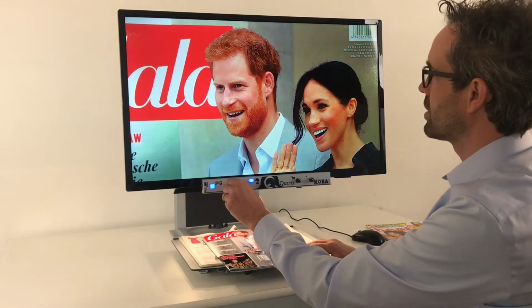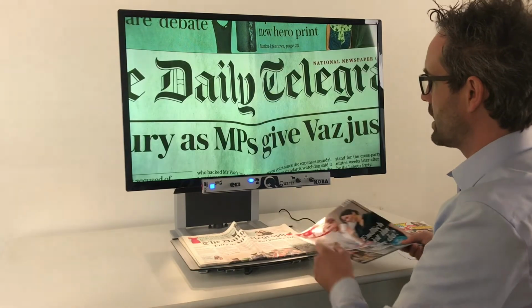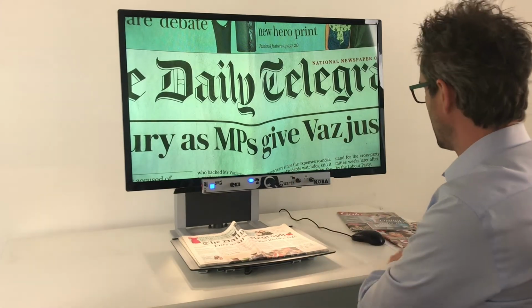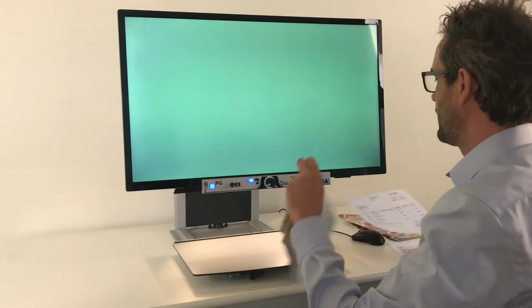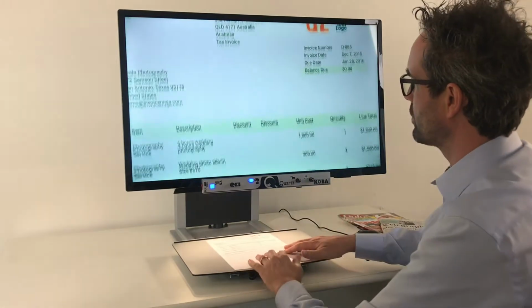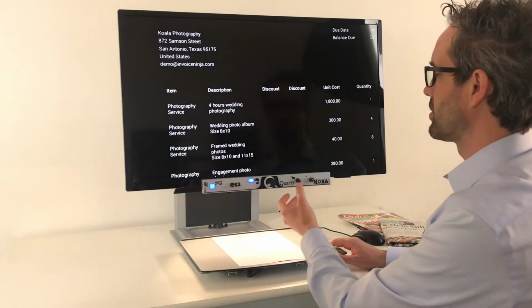You can adjust the brightness, less brightness or more brightness, however you want it. On the right side, you also have some different special functions. We start with, for example, the first tracking wheel. If you press on the tracking wheel, I'll put a black and white example.